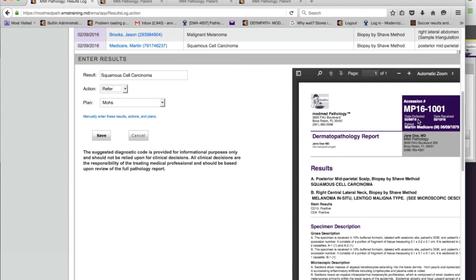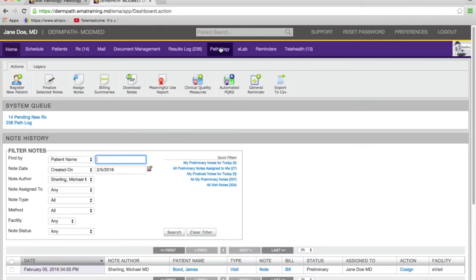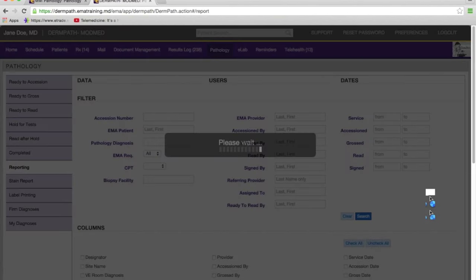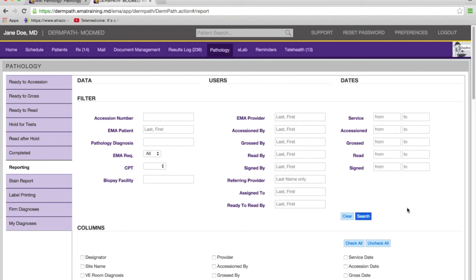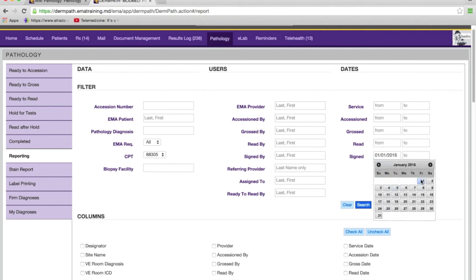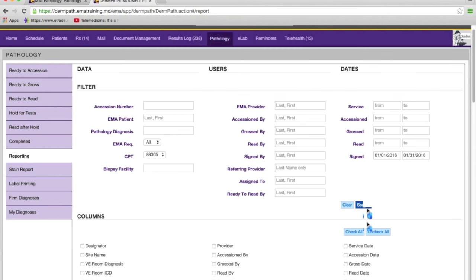The turnaround time is pretty quick. In the next few minutes before I pass it on to Dr. Pettit, I'll cover the reporting screens. I've moved to another system that has a lot of data. In the reporting screen, it's a window to everything going on in the practice. You can query by CPT — for example, look at all cases with an 88305 code that were signed in January.